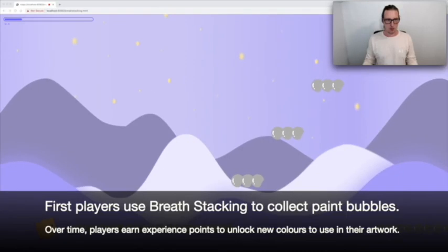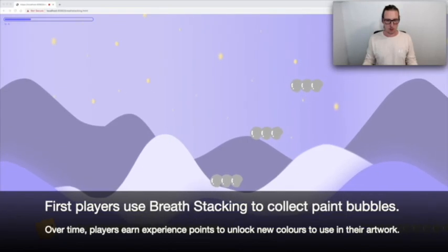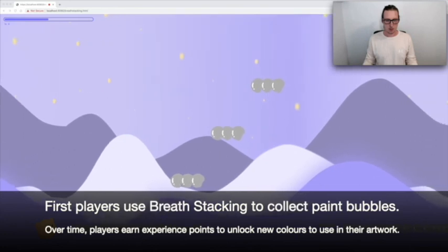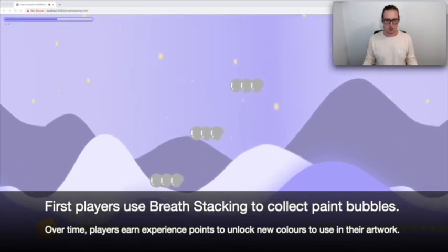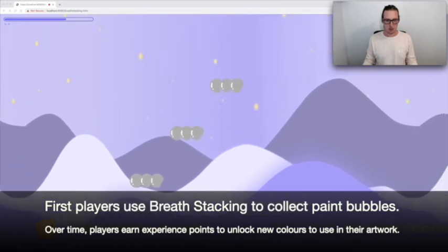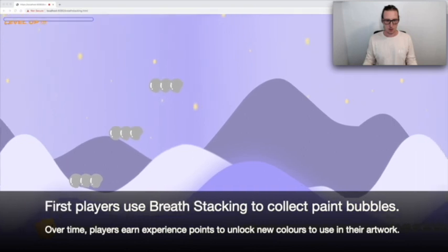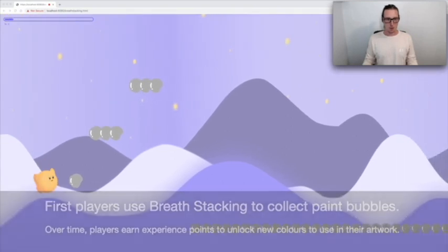Bubble Breather connects these two exercises through an abstract bubble painting activity. First, players use breath stacking to collect paint bubbles. Over time, players earn experience points to unlock new colors that can be used in their artwork.